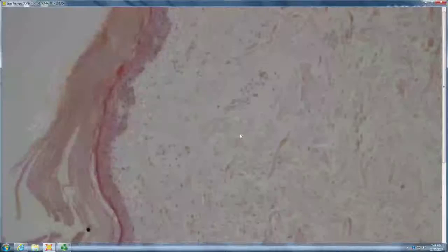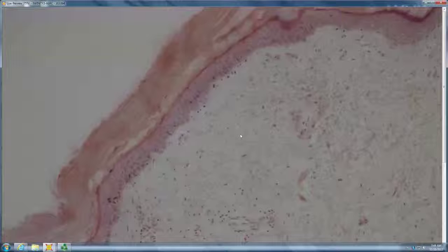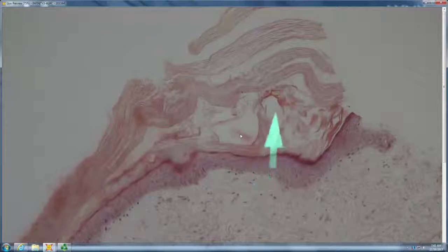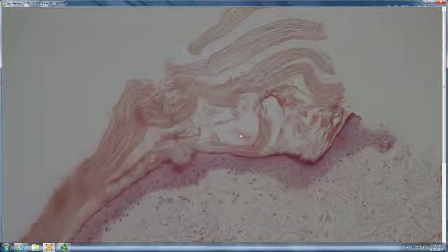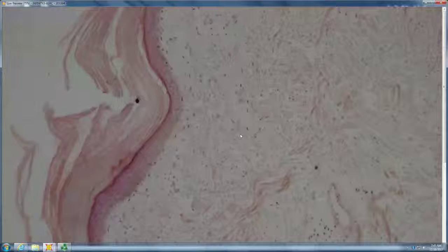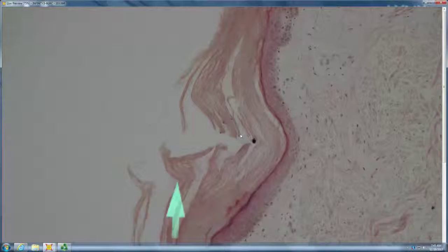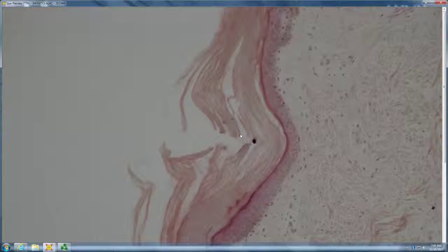Punch from here looks kind of effaced, a little bit boring. The dermis, not too much going on. Looks like there is a granular layer, maybe a little bit attenuated. Yeah, there's certainly a lot of corneum, right? If you thought your granular layer was attenuated, then you'd be thinking probably ichthyosis vulgaris or something more mild. It's unusual for ichthyosis vulgaris to be lamellar, though, to have a lamellar stratum corneum.